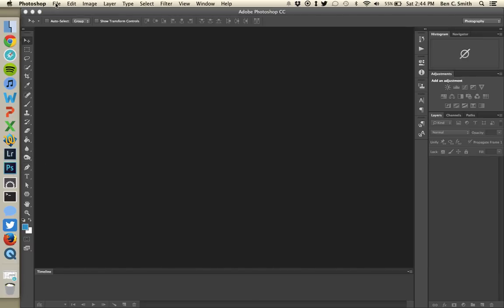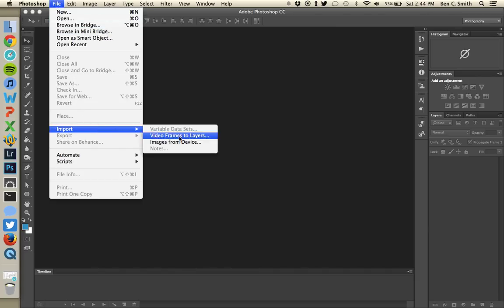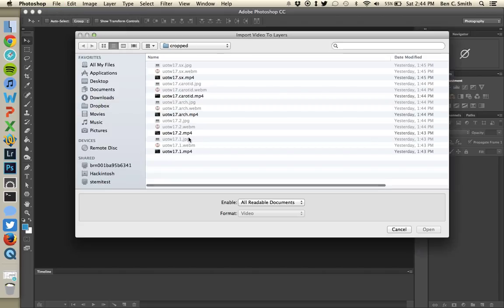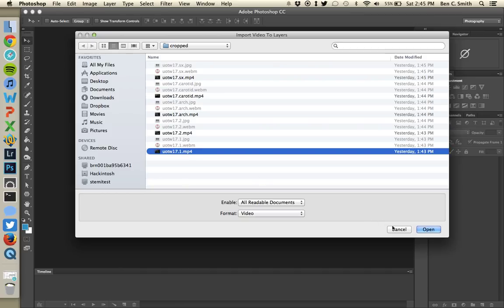The first thing you want to do is go to File, then Import, then Video Frames to Layers. This opens up a new dialog. You want to select your ultrasound clip — I've got a really good ultrasound clip of aortic regurgitation — so I'm going to select that and click Open.